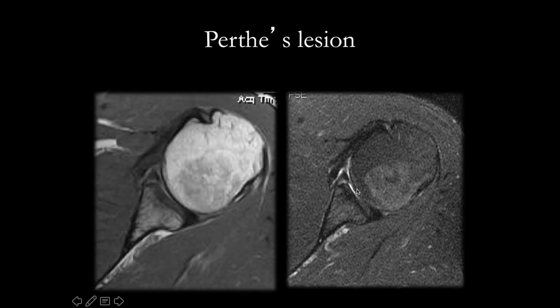If the labrum is torn but the periosteum is still intact, it is a Perthes lesion. As we can see here, the anterior inferior labrum is torn but the periosteum is clearly intact. Our surgeon says that all this differentiation of the different types of tears doesn't matter much to him. His main questions are: is the labrum intact or not? If it is torn, what is the quality of this labrum — is it good, or due to chronic recurrent dislocation, is it worn off and degenerated? The other question he is interested in is glenoid bone loss, which we will come to later.